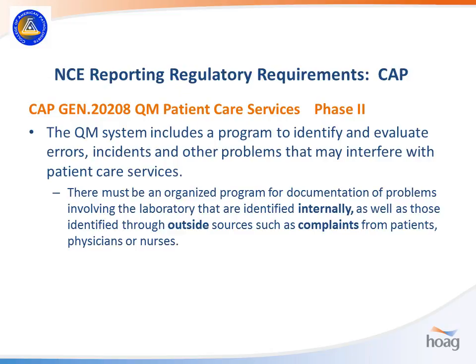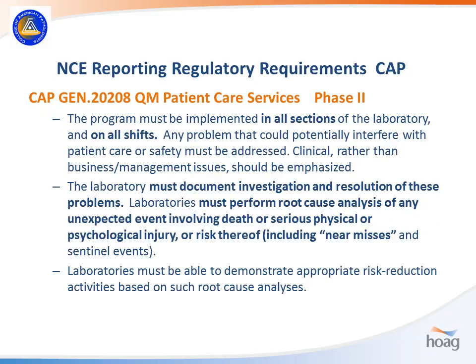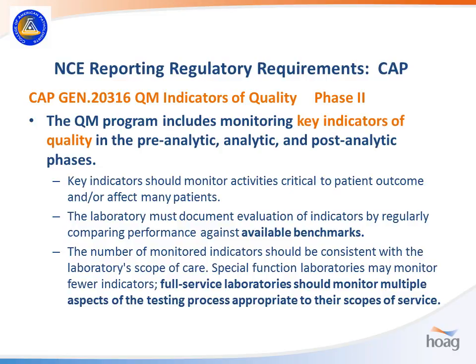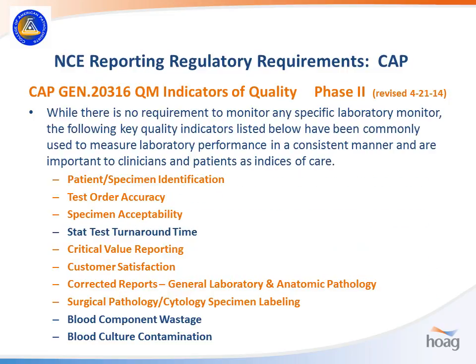The CAP requires a system to identify and evaluate errors both internally and from outside sources — complaints from patients, physicians, and nurses — and that is a phase two requirement. The program must be implemented in all sections of the laboratory and all shifts. You must document investigation and resolution of problems, perform root cause analysis of any unexpected event involving death or serious physical injury, and include near misses even if they didn't result in actual harm. You must also have key indicators of quality in all three phases of testing. Several of the CAP-suggested key indicators can be mined directly from your non-conforming event data.